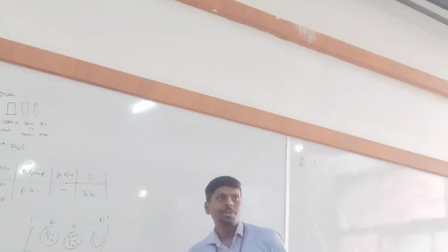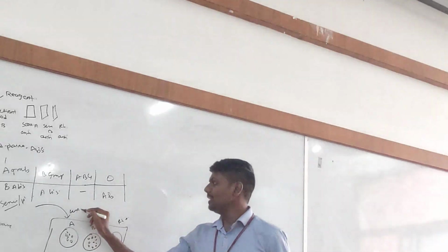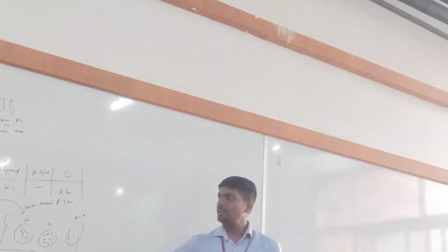To these cells, now I will add my unknown patient serum. Got it? I added the patient's serum.